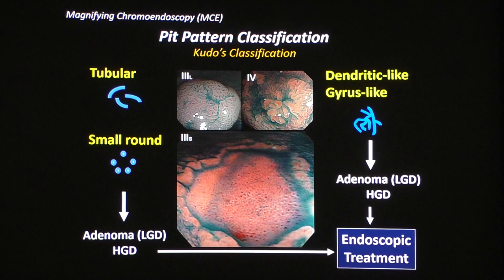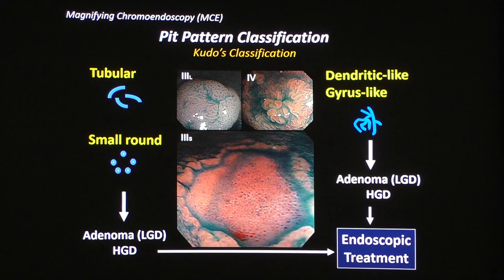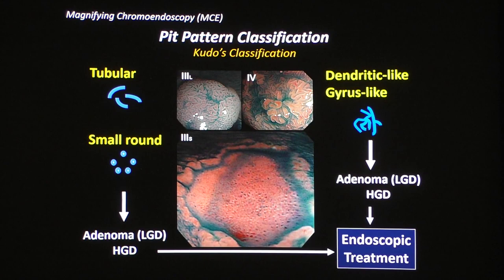If you see dendritic-like or villous-like pit patterns, the pit pattern is called type 4 pit. It also indicates intramucosal neoplastic lesion, sometimes high-grade dysplasia. You also have to remember type 3S pit, sometimes observed in LST non-granular type lesions. The pit itself is smaller than type 1 pit. This pit pattern also indicates intramucosal neoplastic lesion. If you see these pit patterns, we can understand the lesion is indicated for endoscopic treatment.